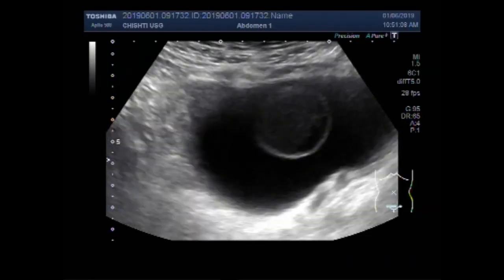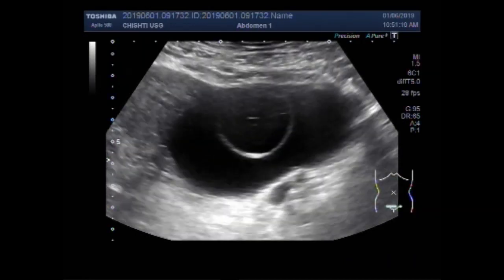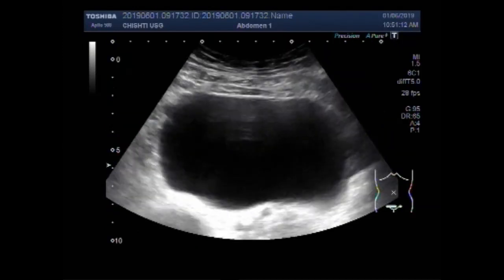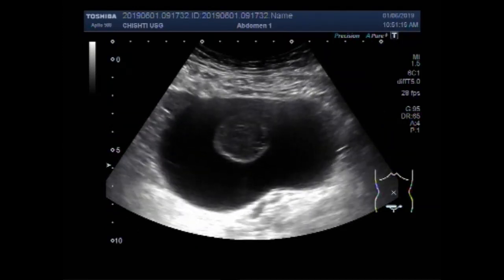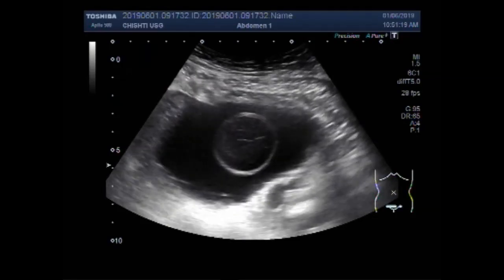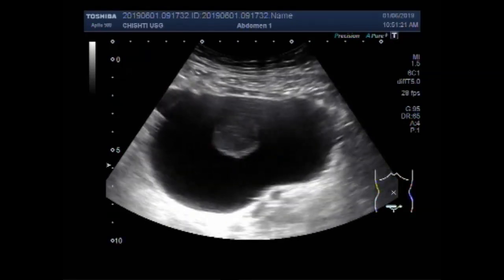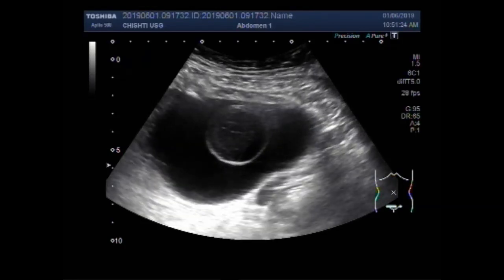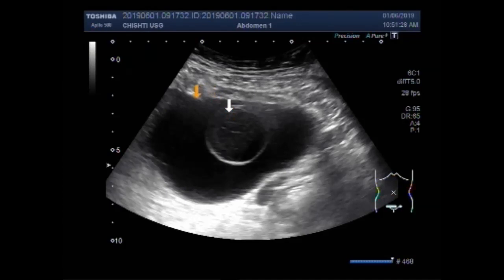Now this is the right ovarian cyst, and you can see a daughter cyst is also seen inside this large ovarian cyst. You can also see that the daughter cyst has a thick fluid inside it, with multiple internal echoes in it.